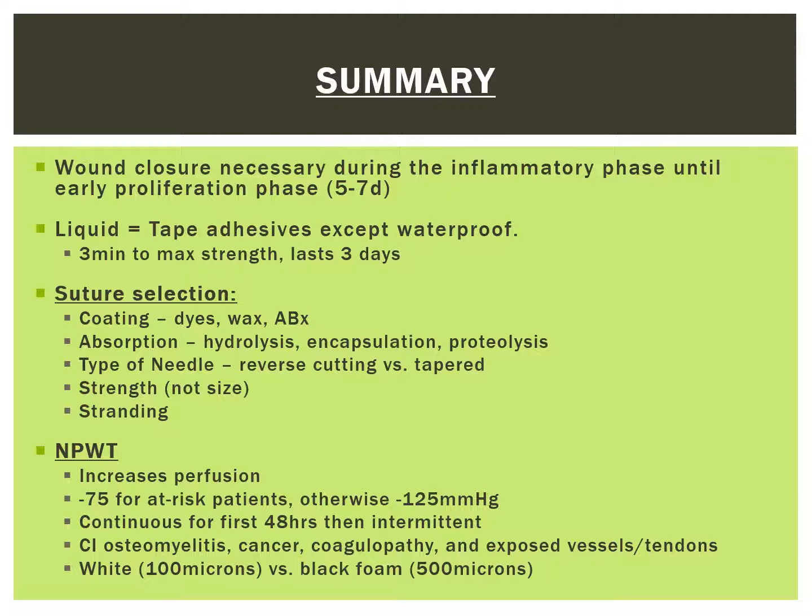They can be used in some circumstances when you change the type of foam being employed. The white foam is only about 100 microns in terms of its pore size compared to the black foam, which is 500 microns. Therefore, the white foam allows for more moisture retention.